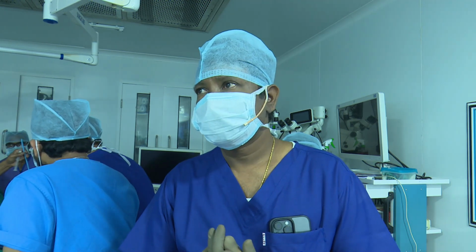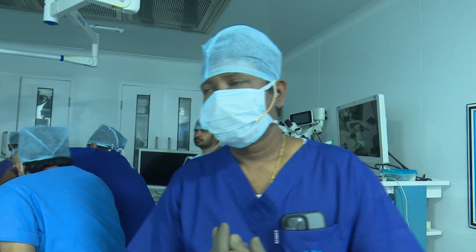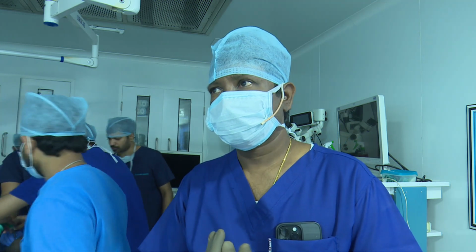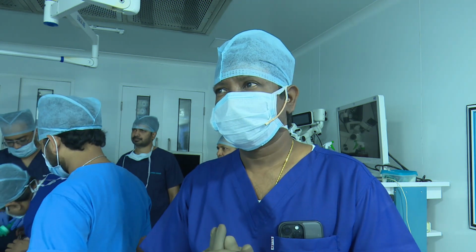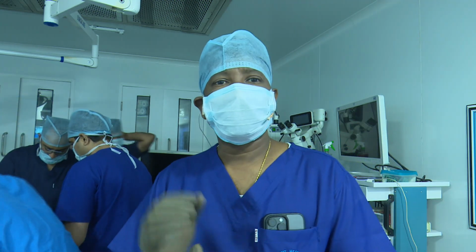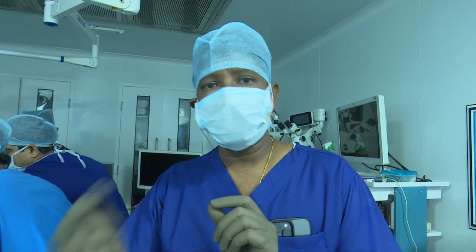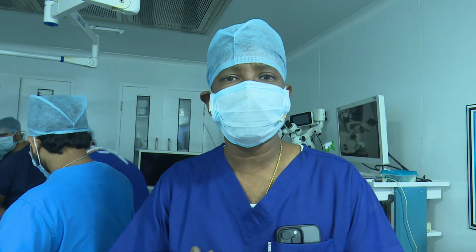Third one, yeah, the interventional DISE part of it. So when you pass the nasopharyngeal tube down, initially you go beyond the uvula or the soft palate, and suppose the patient's snoring stops at that time. Apart from looking at epiglottic collapse, does it also give you any other information? Yes, usually if it is a 2.3 mm fine endoscope, we can go through the nasopharyngeal airway. Otherwise, I would prefer to go through the other nostril so that we don't block the passage of the nasopharyngeal airway, which is supposed to do its function.